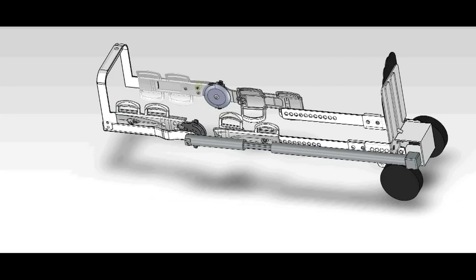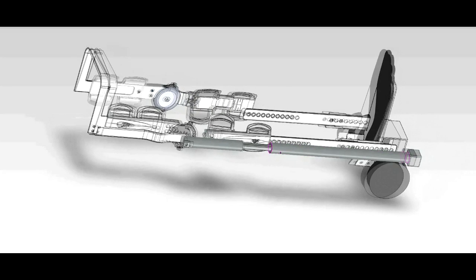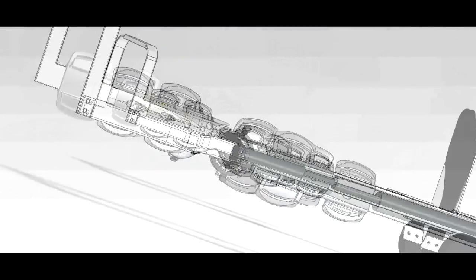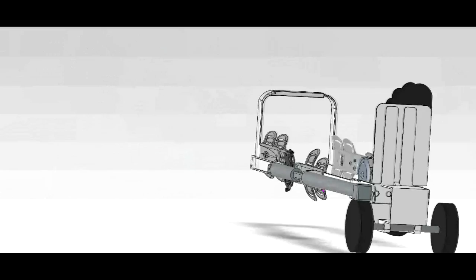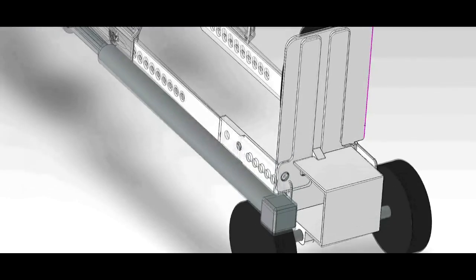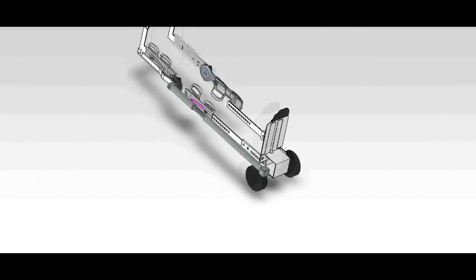Pictured above is the first version of the continuous passive motion device. It is built to integrate directly into the Össur DLX knee brace, also seen here. The device would be powered by an electric stepper motor mounted at the bottom of the footrest. The motor delivers power to a drive shaft which runs along the length of the device and applies torque to the brace at the pivot point, causing the brace to bend.